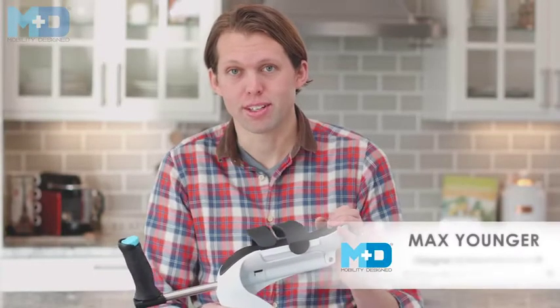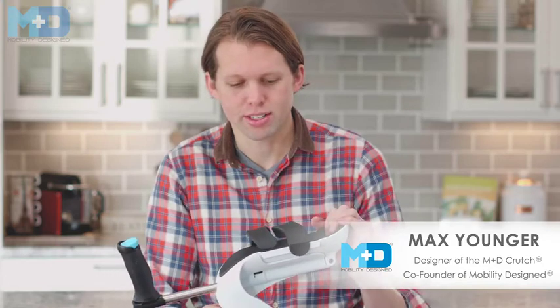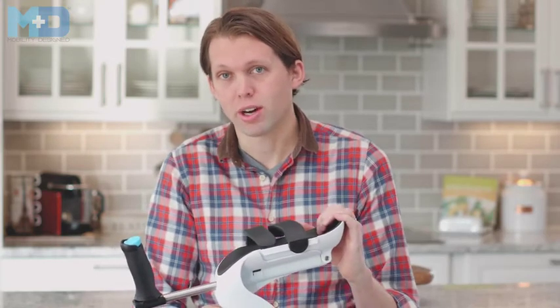Hi, and thank you for your purchase of the MD crutch. I'm Max Younger, the founder of Mobility Designs, and we designed this crutch for you. Today I'm going to walk you through the out-of-box setup and sizing of your MD crutch to help you step into the future of mobility.